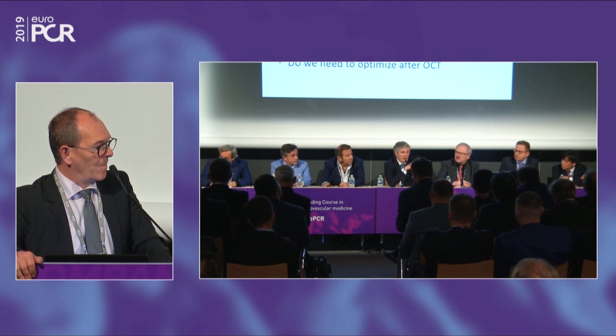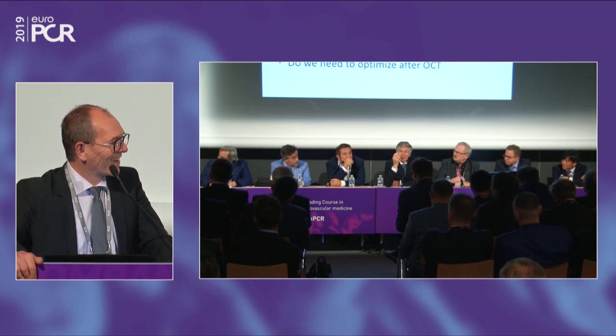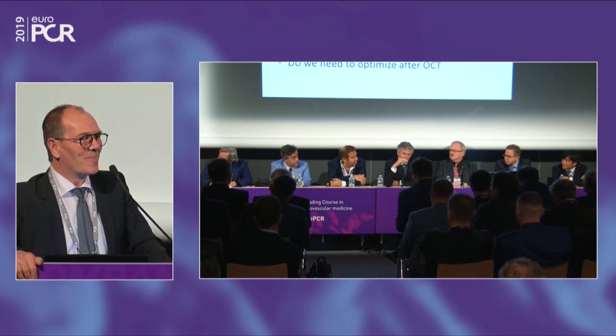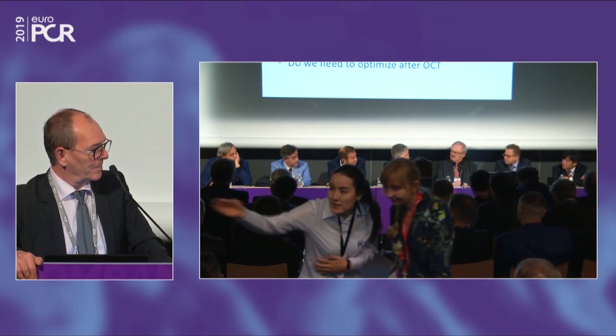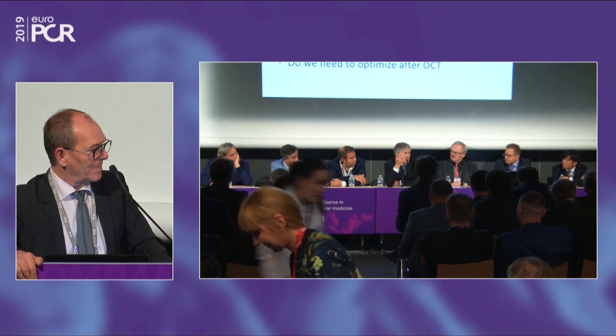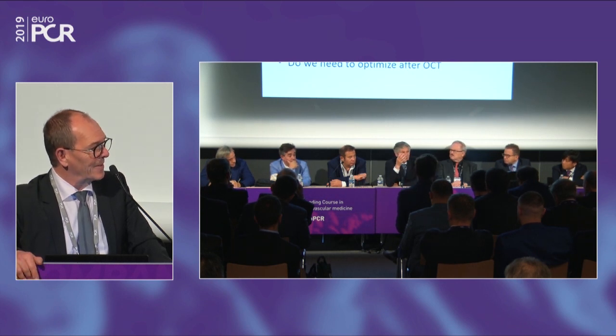Yeah, very good. I think it's a very important point, because of course not everybody has the possibility to use lithoplasty in the coronary arteries. It's very expensive also. You can do it, but it's very expensive. And I think that many people are using rotablator with a small burr. In this case, the reference diameter is 3.5, so 1.5 is less than 0.6. The magic number for rotablation is 0.6, and I think we should follow this magic number, except if you use lithoplasty after rotablator.